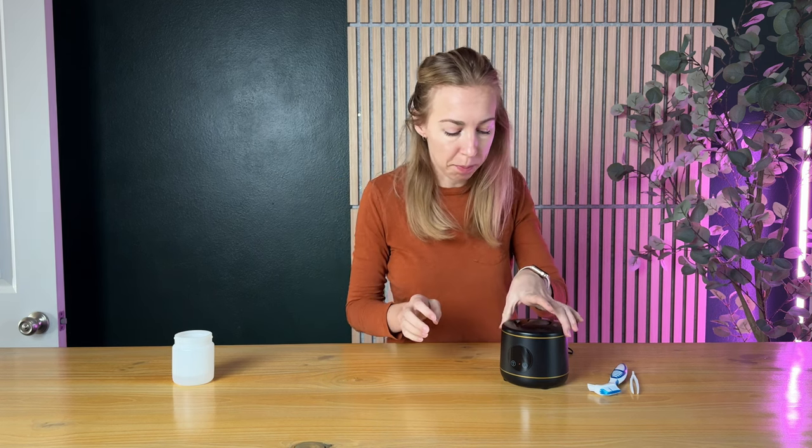Those three beeps meant that it was all finished cleaning. So I'm going to pop this lid off — the water is not very hot, just lukewarm, not even quite that. I take my night guard out and it is looking nice and clean, nice and shiny. I'd say this works really, really nicely.